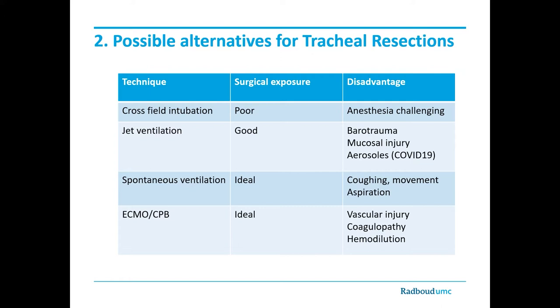Surgery during spontaneous ventilation is difficult because of movements and coughing. There is also an increased risk of aspiration. For ECMO, there is a risk of vascular injury and coagulopathy. But since a few years, we have an alternative, and Marieke takes it over from now.